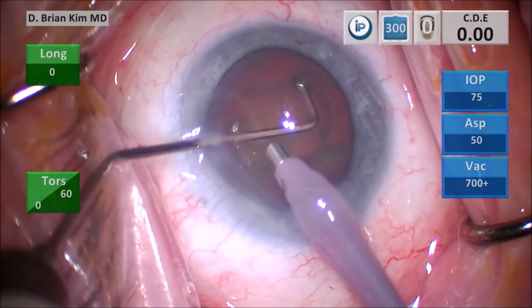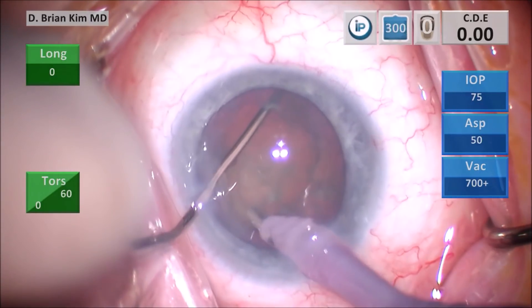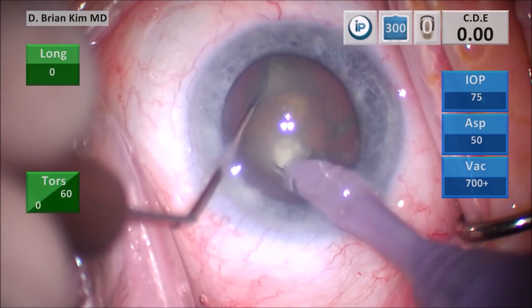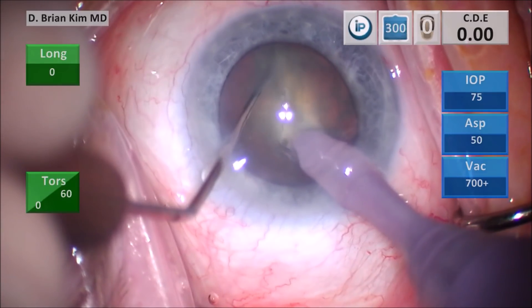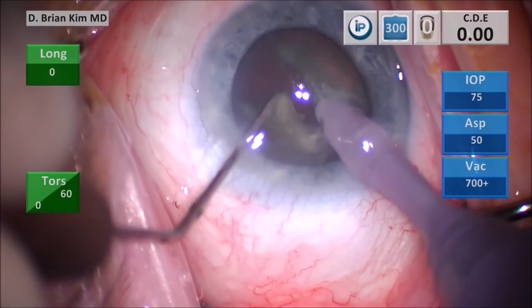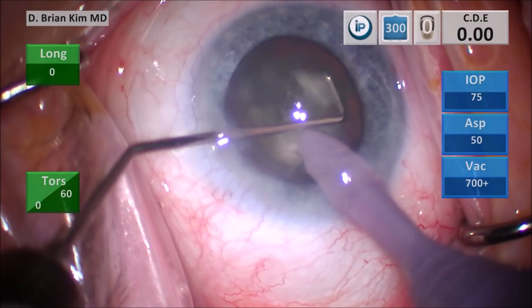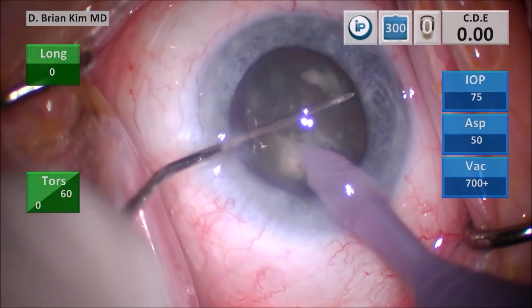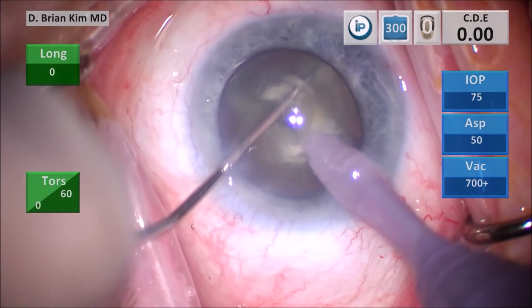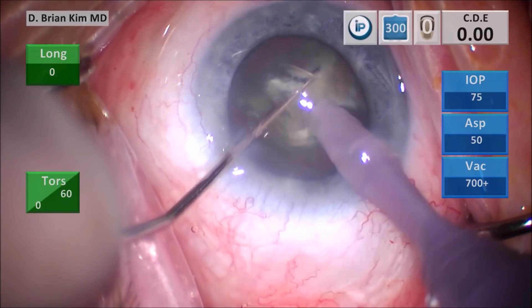Let's go back and do this as a stepwise approach. First, I'm going to lead with the chopper. I like to pronate my hand and push down on the lens material as it glides across, making sure it's under the anterior capsule. Once I'm out to the equator, I supinate my hand. I'm placing the phaco tip just sub-incisional and torquing my hand so it's more in a vertical position, so the chopper and the phaco tip are both in a more vertical position. I bring the instruments together and it crushes the lens material in between. I pronate my hand, gliding and pushing down on the lens to make sure I'm under the anterior capsule, gliding out contra-incisionally, and then rotate and supinate into correct position, and pull the chopper towards the phaco tip — this initiates the cross-chop maneuver.